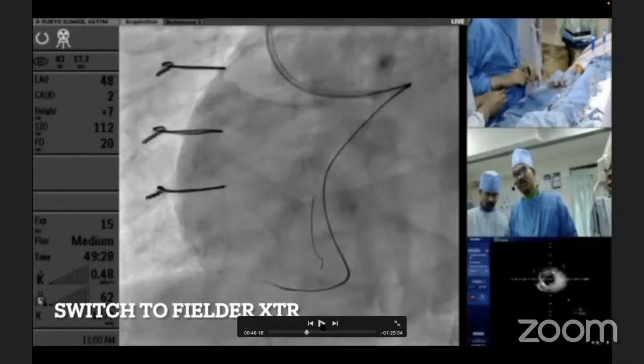Beyond the catheter fatigue, the human mind fatigue, the team fatigue, the patient fatigue also comes in. After the first 1.5 hours in the same case, you may do 10 small cases and never get fatigued. But in one long 4-hour case, in the last 2 hours you are only worried that no thrombus should go, no air should go, is he bleeding, what is the pressure? So it becomes difficult. That is why it turned out to be an investment procedure. But with skills like this, it will not be an investment procedure if it was one CTO in a day.